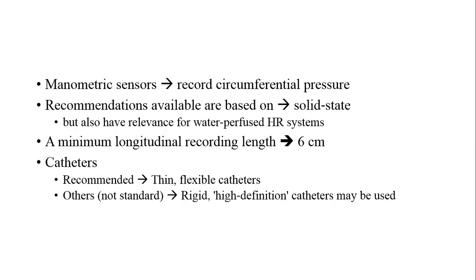Manometric sensors record the circumferential pressures that happen in the anal canal. The recommendations that are available now are based more on solid state manometry systems. At the same time, the catheters that they recommend are thin flexible catheters. There are other catheters, however, these are not standard.